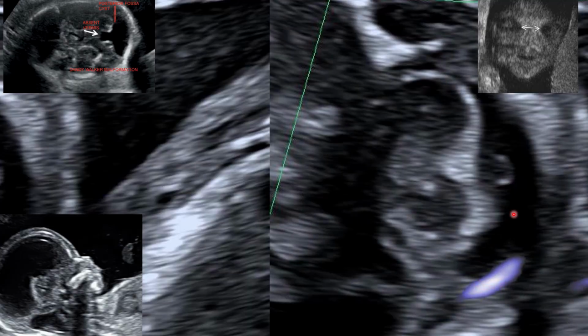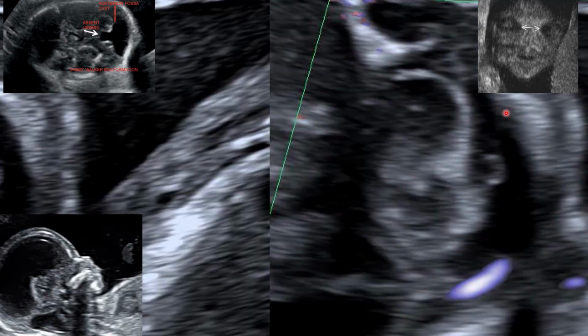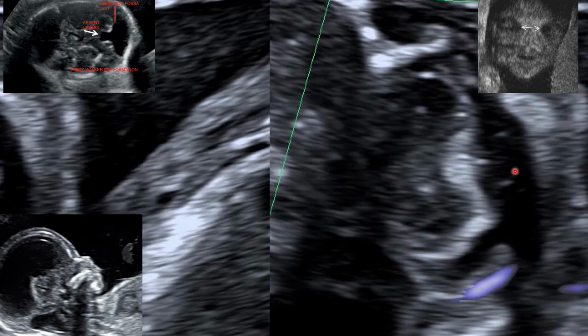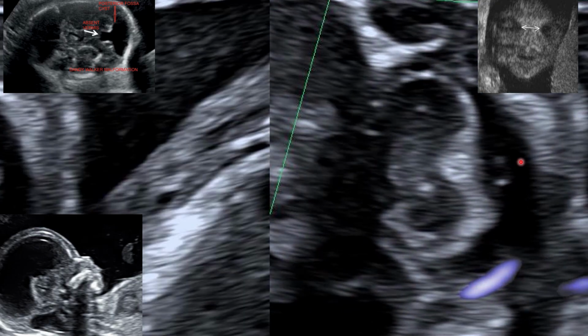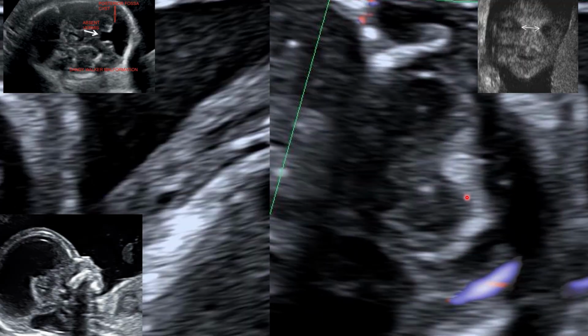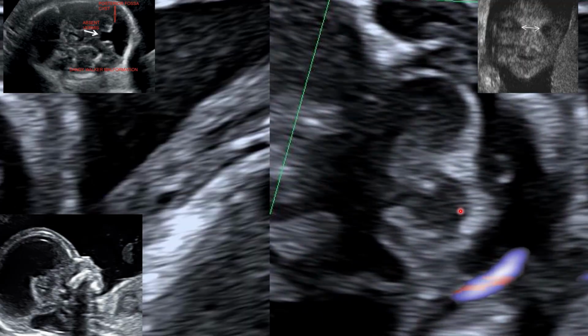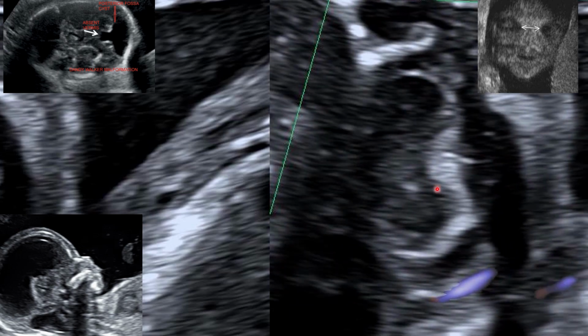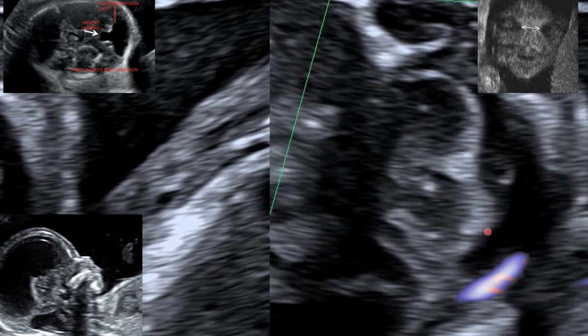This fluid, if you zoom, can give an illusion that it is a little bit elevated. So just measure that distance and then you can have a correct account of what you are doing. This is how you do it in the second trimester.